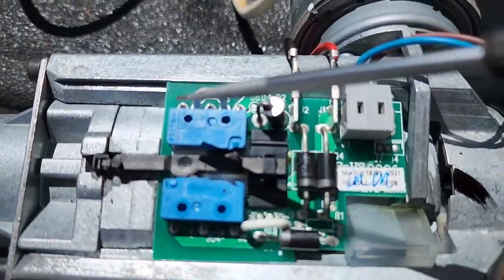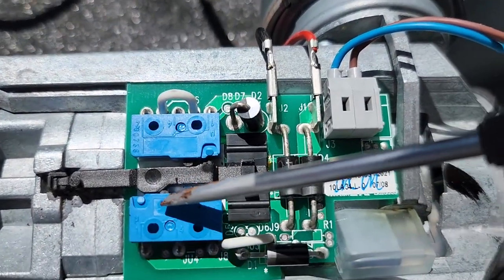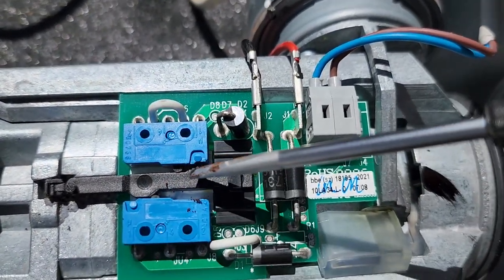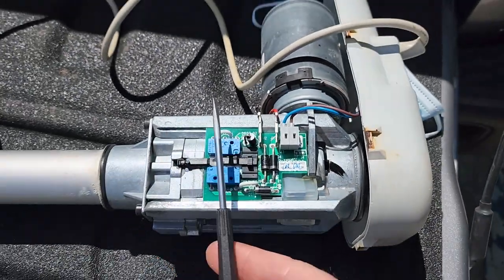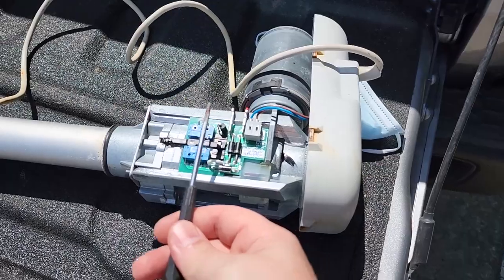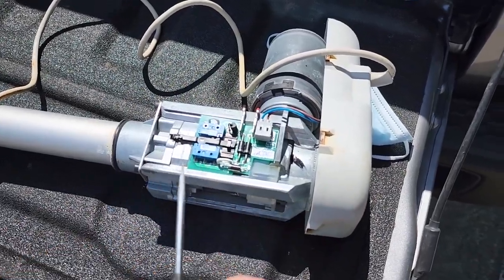Now, if you notice, there's not very much room for error. You can see this one here and this one here, they're really close. There's like 1.5 millimeters worth of travel. So there's not very much detection travel on this linear actuator.